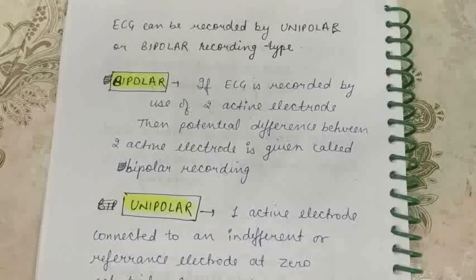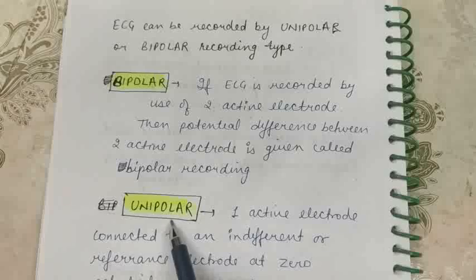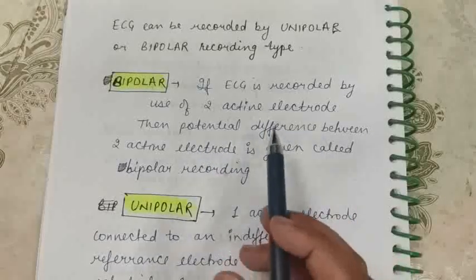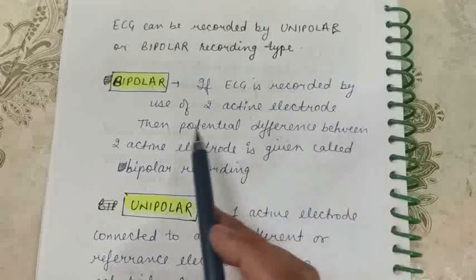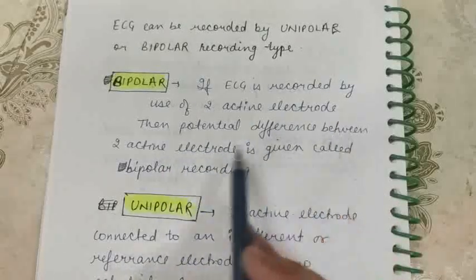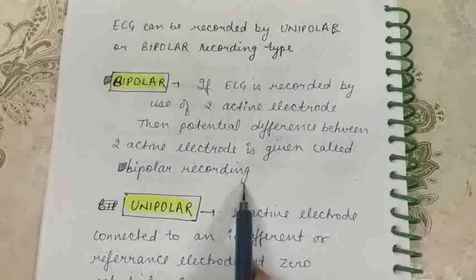To have a better understanding, we should also know about two terms, bipolar and unipolar. Since we are applying two electrodes on the surface, we should know which type of recording it is, bipolar or unipolar. Bipolar is when the ECG is recorded using two active electrodes, and the potential difference between these two electrodes is monitored, which is called bipolar recording, right?